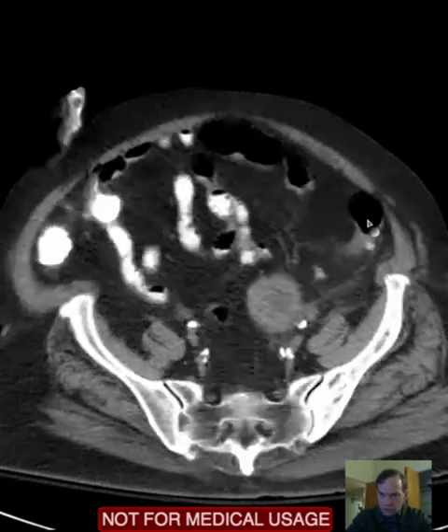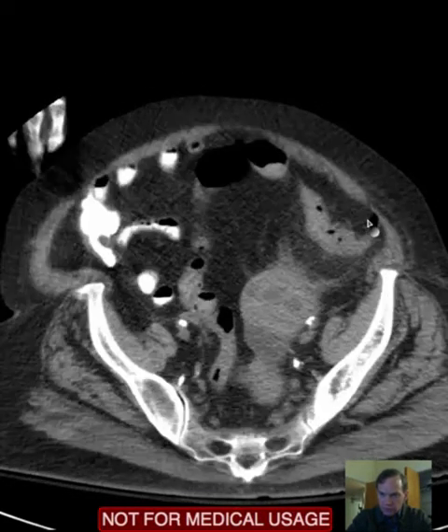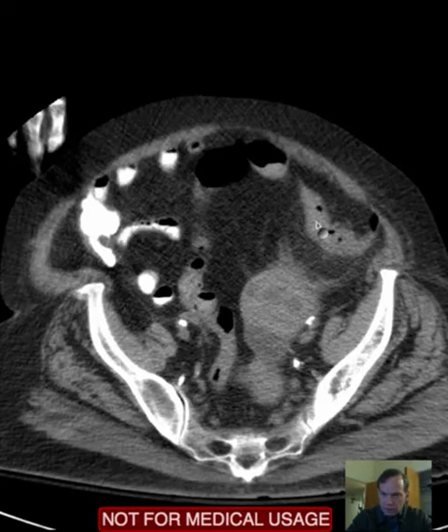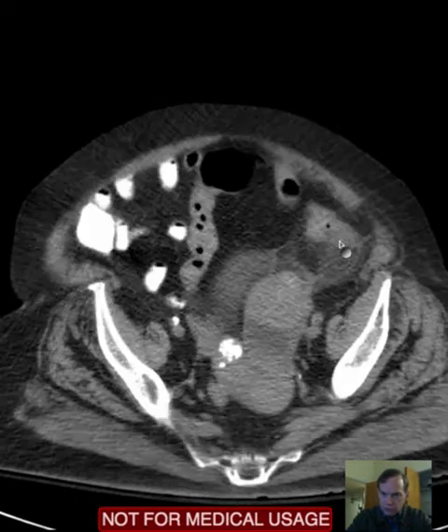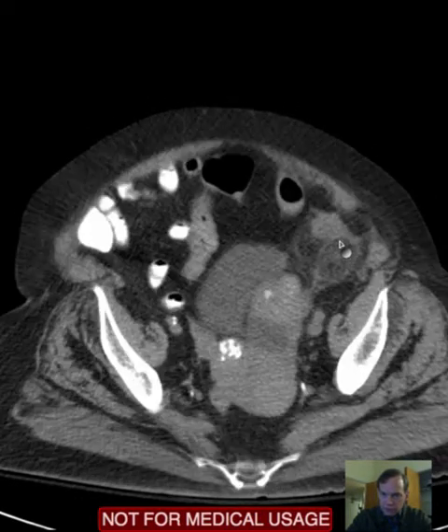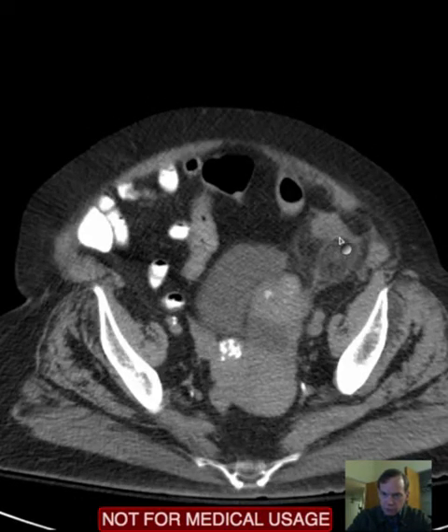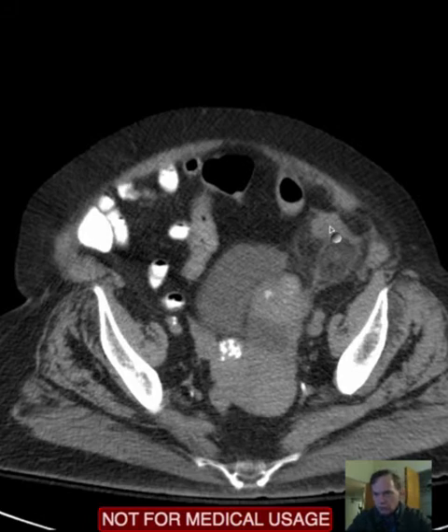So this is left colon, left colon, and then this is the beginning of sigmoid colon. So it's right adjacent to the sigmoid colon.